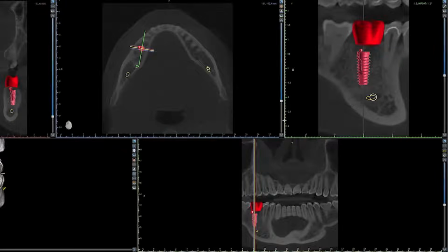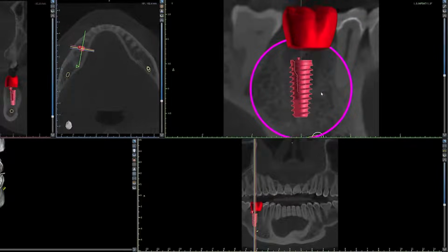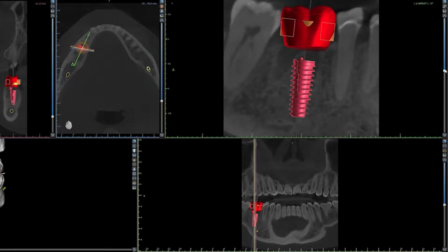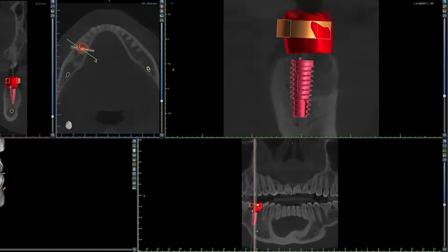I'm going to compare this implant to the position of the crown, which I know the crown's in a good spot. And I'm going to see that it's angled correctly, splitting kind of the difference between our molar and our premolar in all directions. So in between, it's called mesiodistally. I want that to be placed correctly. And then buccolingually, so from the tongue to the cheek, I want it to be placed in the middle. And so both of those are going to be tweaked here as I'm kind of playing around. And now we get it right down the middle of that crown.